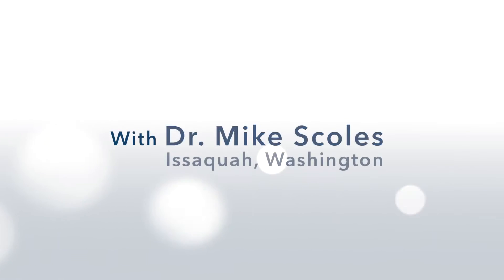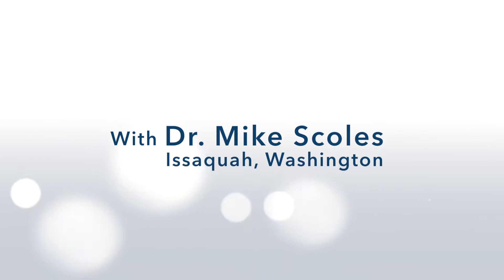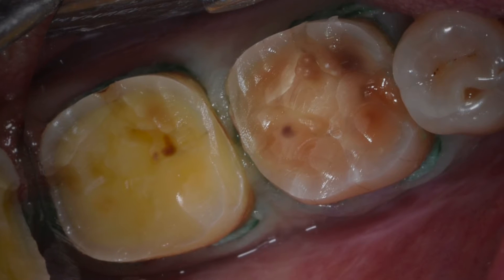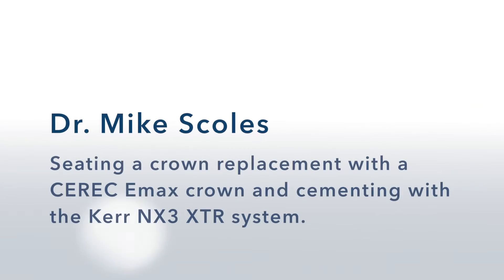Matt has a zirconia crown where the porcelain broke off the interproximal and he's getting a food impaction, so we have to remove it. With an Emax crown, we're getting a full 400 megapascals of compressive strength because it's monolithic and the material is much stronger.